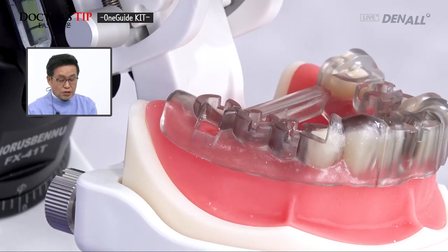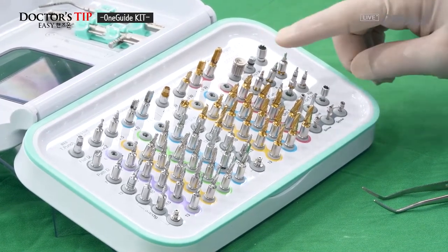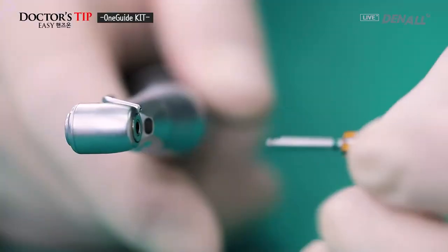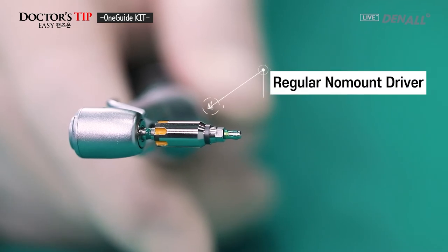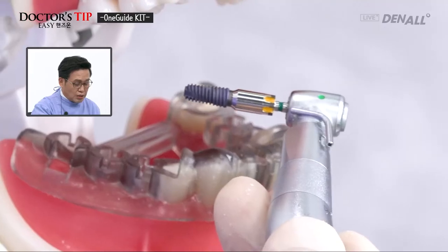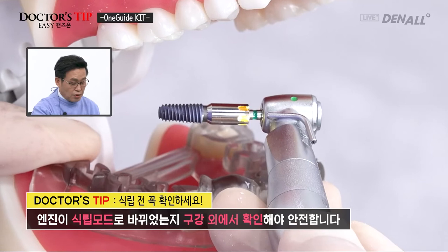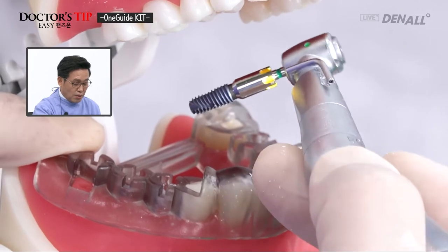Drilling is now complete, and after that, the no mount driver is going to be used. Mini, regular, wide, there are three options. The 4.5 regular size is going to be used, and the no mount driver is selected. It has been chosen. You're going to change to placement mode. Also, always check extraorally that this is placement mode. If it is in drilling mode, it can be a problem.